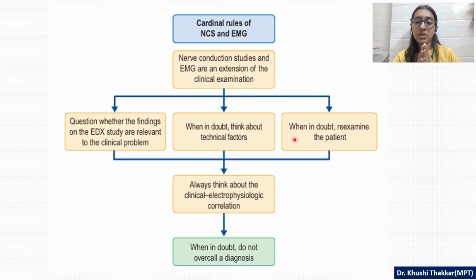Now, combining all three, always think about clinical electrophysiological correlation. That is, kindly correlate your clinical findings with the electrodiagnostic findings. And when in doubt, do not overcall a diagnosis, please.